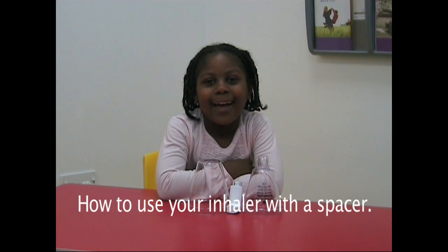My name is Quincy and I'm going to show you how to do my inhaler and my spacer.